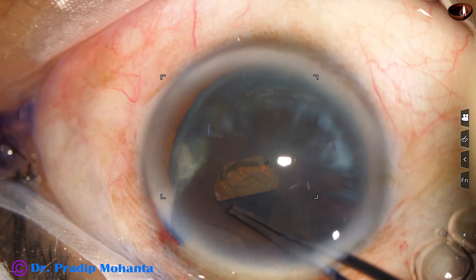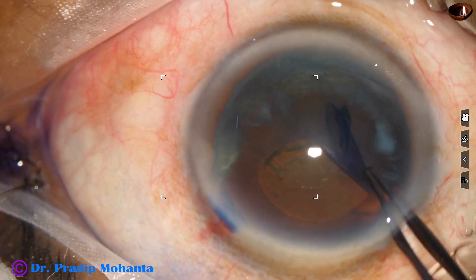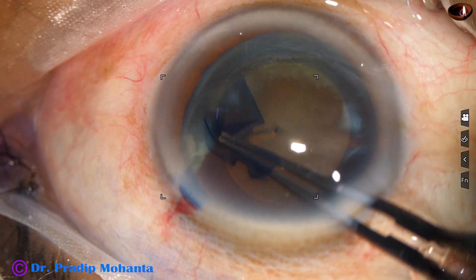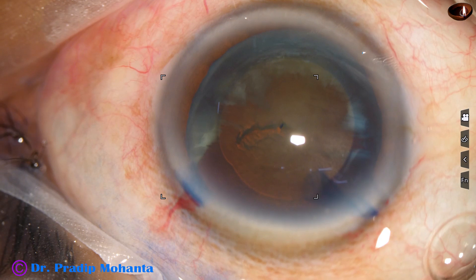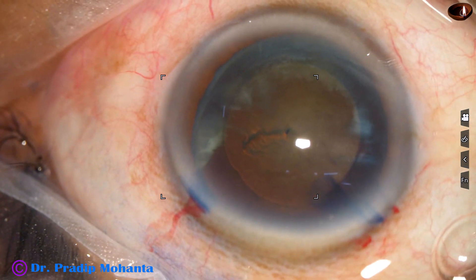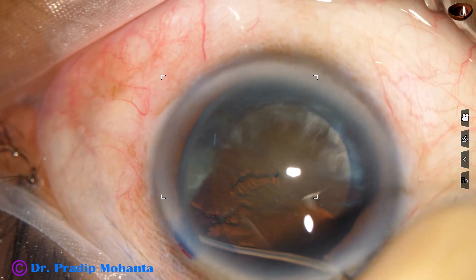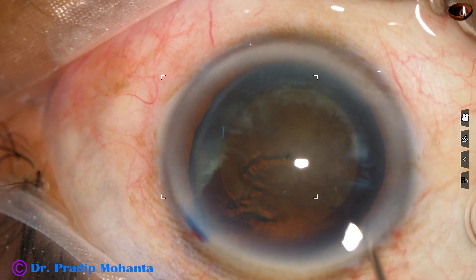So after cleaning the dye, the anterior chamber is filled up with visco and capsulorhexis is being done with the utrata forceps. A nice round rhexis of about 5.5 millimeters has been done. Now hydrodissection is done.